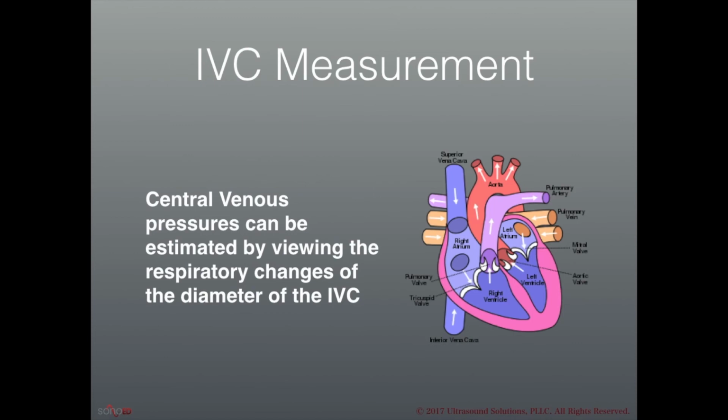What I want you to think about the IVC as a marker of is central venous pressure. And what we're going to do to measure that is measure the diameter of the IVC and also estimate the respiratory variation of how much that diameter changes when the patient takes a breath.